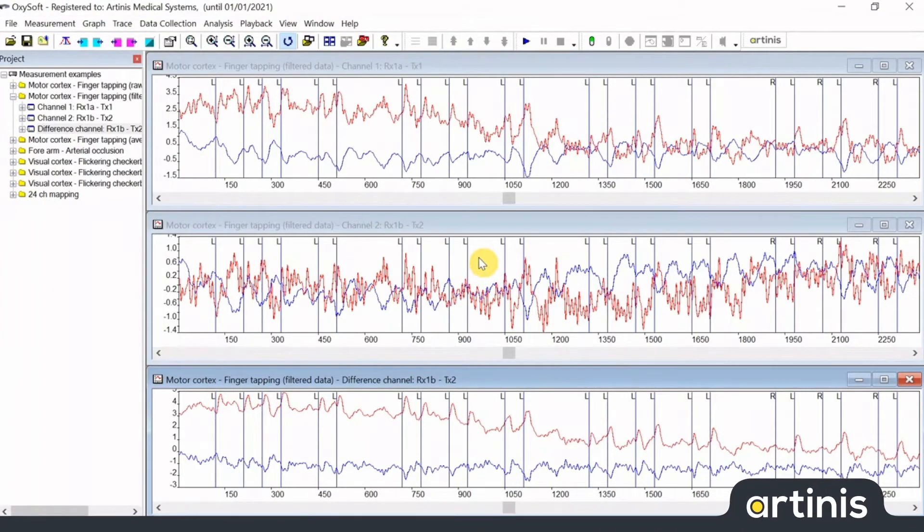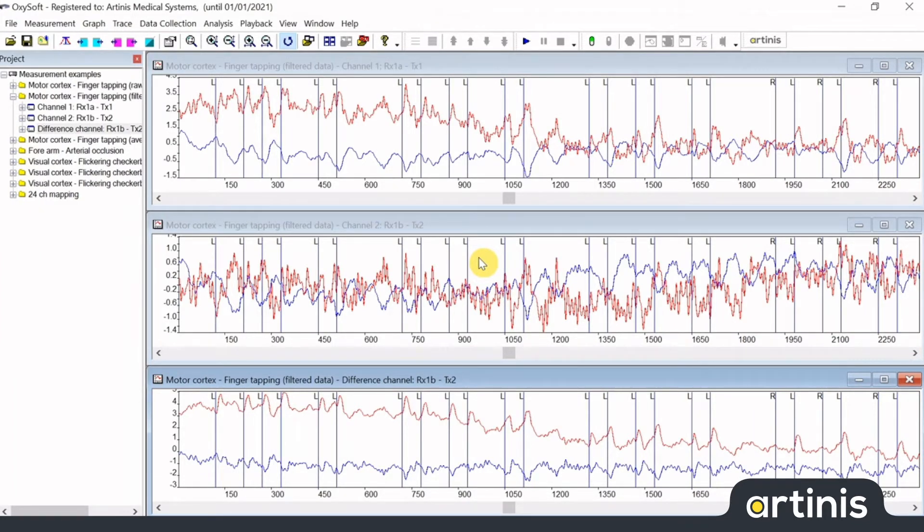Hi, my name is Thierry from Artinis Medical Systems. In this video I will show you how to place events in Oxisoft.